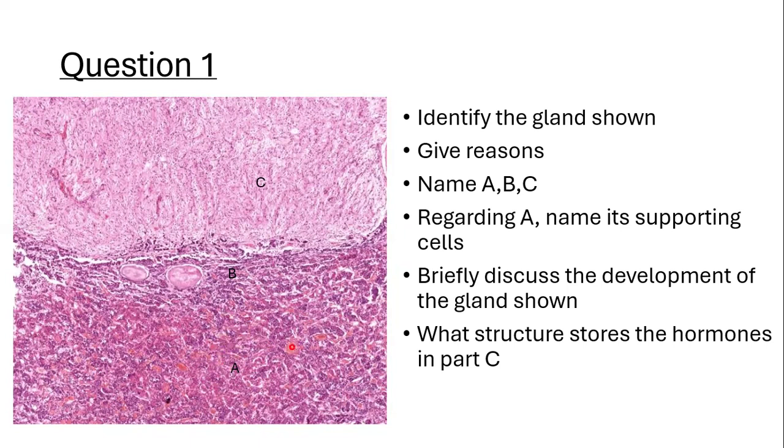Maybe you've not had this, but it is the folliculostellate cells. I'm typing it in the chat box. Folliculostellate cells. You need to remember that. Take note of that, they might decide to ask you. So folliculostellate cells are the supporting cells of the adenohypophysis.